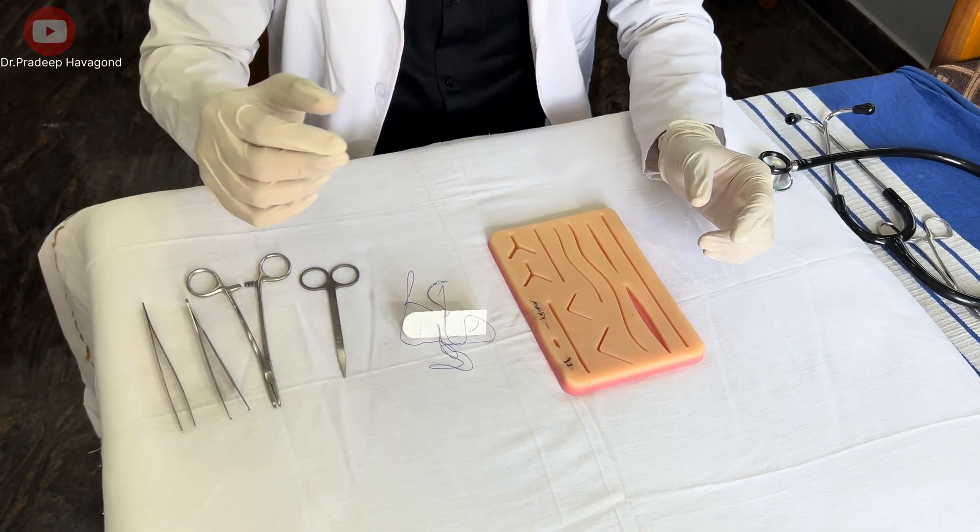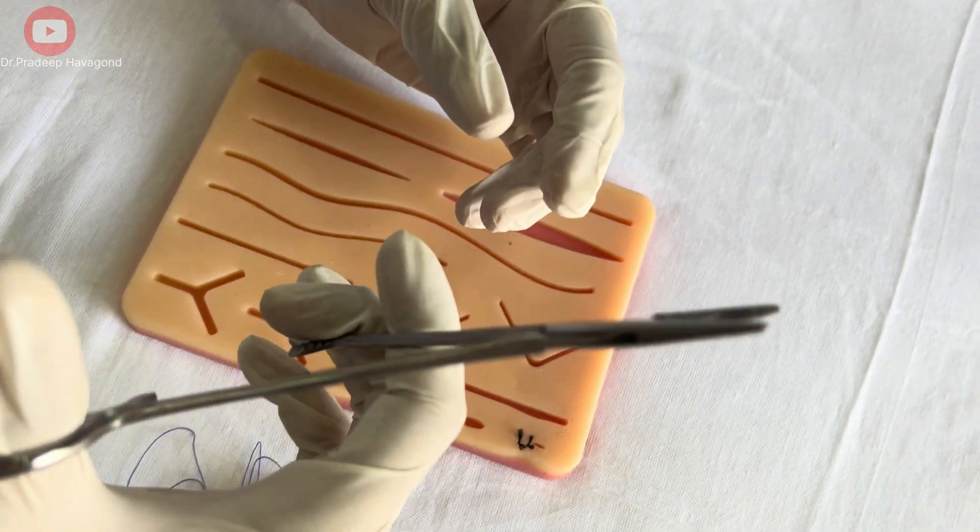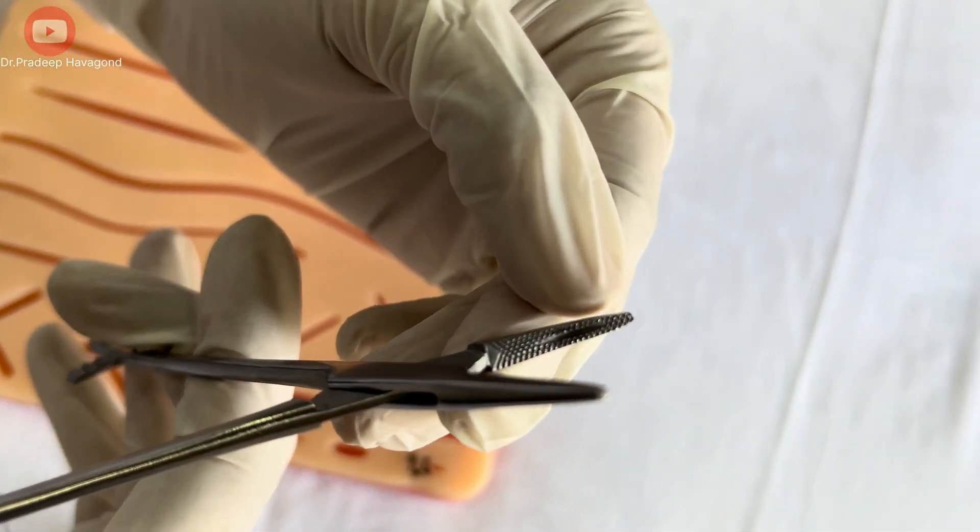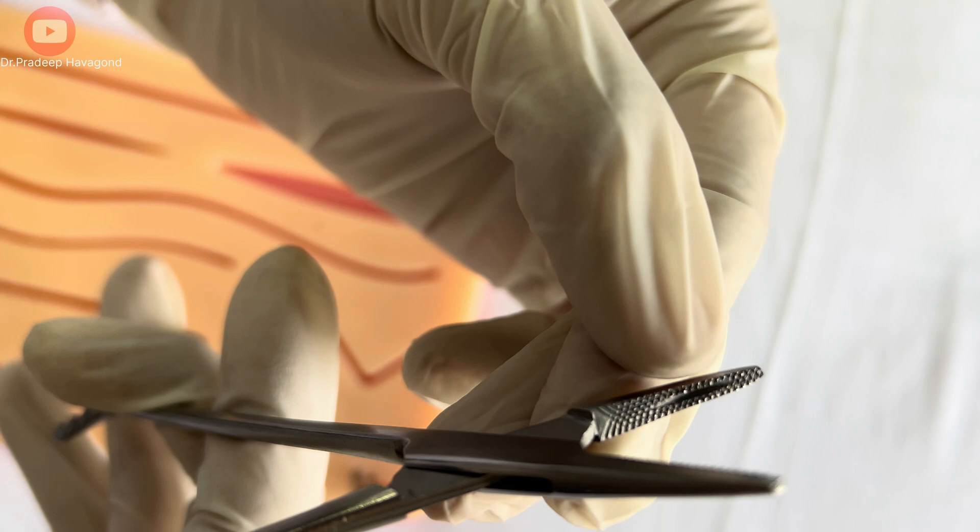Alright, let's get started. Now see, this is the jaws of the needle holder. Here the suture needle is held.